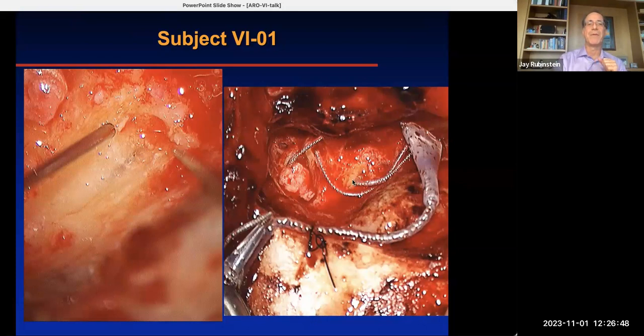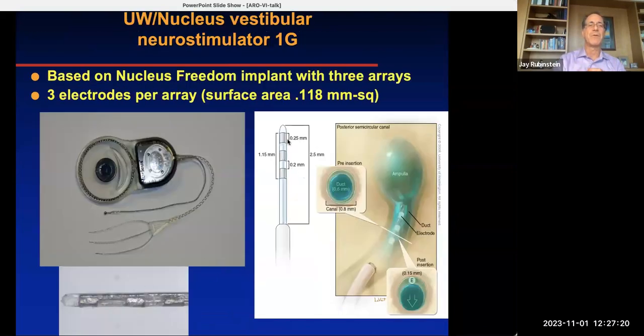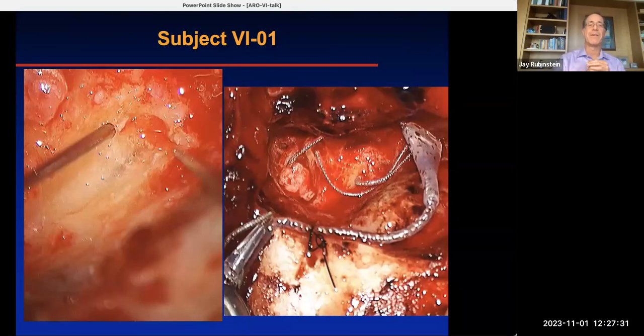And this is the electrode array in the posterior semicircular canal. This is the electrode array in the lateral semicircular canal. And this is the electrode array in the superior semicircular canal. You can see part of the receiver stimulator back here, and then a stitch securing the electrode array into the mastoid to stabilize those electrodes. And electrode stabilization was a really important thing to achieve, because as you saw from the previous image, these electrodes are very, very short. They were 2.5 millimeters in length, and there's not a lot holding them in the superior canal. And in our monkey studies, we found, not uncommonly early on, until we figured out how to better stabilize the array, that the arrays tended to come out because the monkeys pull on their ears a lot postoperatively.